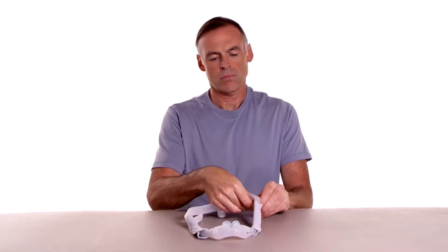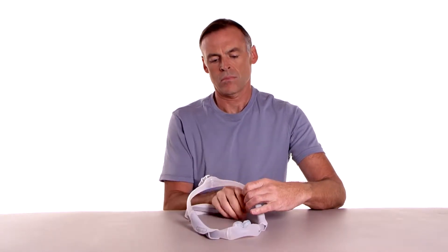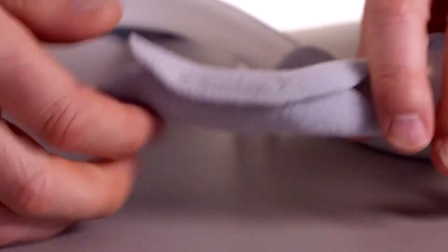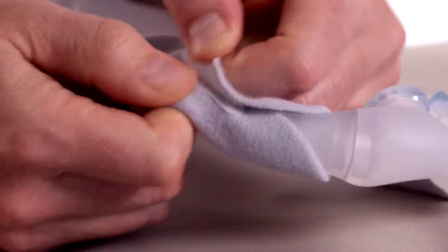To disassemble, release the headgear tabs and pull the straps through the slots in the mask frame. Undo the strips and remove the fabric sleeves.